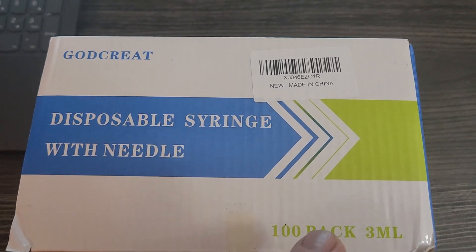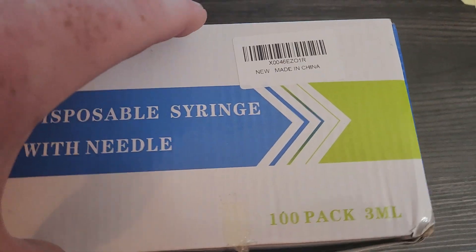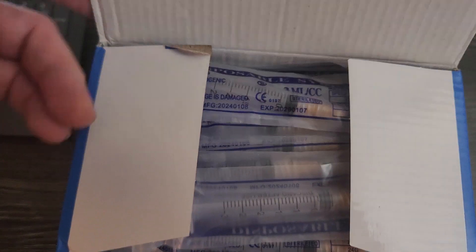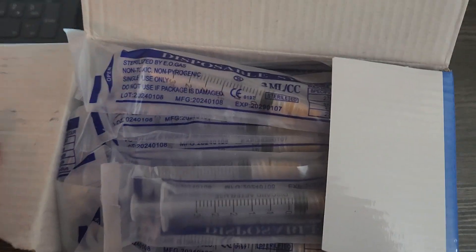So I just got this 3 mil — it's a 100 pack of 3 milliliter, 25 gauge needles. They're sterile, disposable, individually wrapped, which is nice.